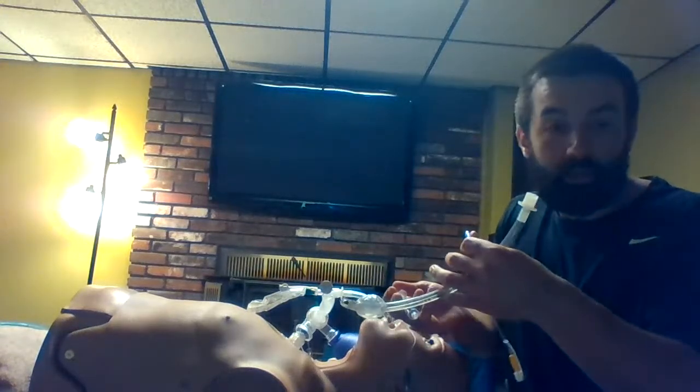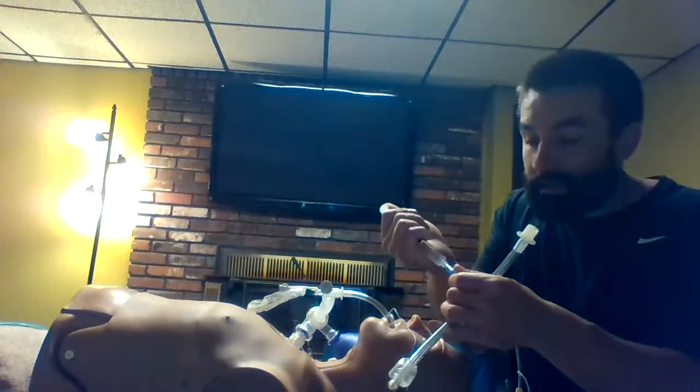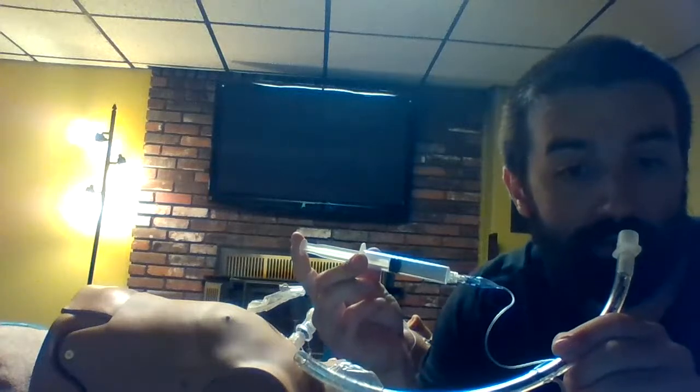So this is an ET tube, nothing wrong with this one. What I want to show you is as I put air in, come to you a little bit closer, as I put air in, that cuff should inflate. And watch. We know that there's problems with putting too much air in for long term. But whenever I come up and assess the situation, first off, I want to know, did that patient's leak stop? Not only if that leak stops do I know the cuff's okay, but if I see something like this, hang on, I overinflate that cuff just slowly. And then what you would see is there's so much pressure that builds in that cuff, it should have enough force to push that syringe back right there.